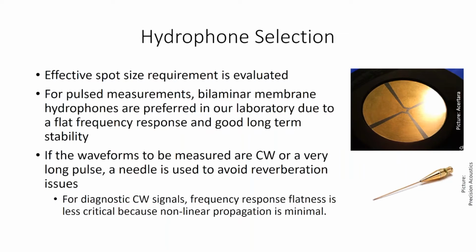Okay, in our laboratory, and I believe in most laboratories, hydrophone selection is a process. The first thing we need to consider is the frequency and likely spot size of the device that we're measuring, so that we can make sure we're using a hydrophone with an effective spot size. The requirements are well defined in the standards that is adequate to measure the device being tested.